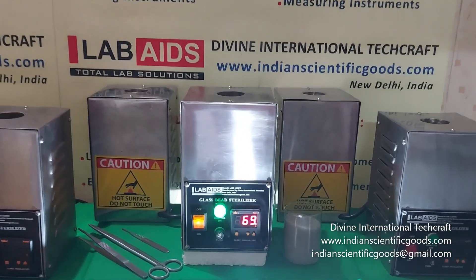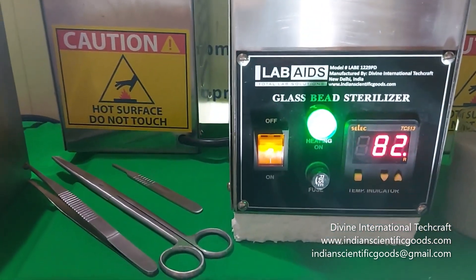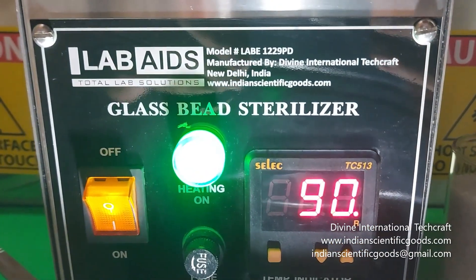These glass bead sterilizers are suited for sterilizing small, solid, metal and glass lab instruments within 10 seconds.